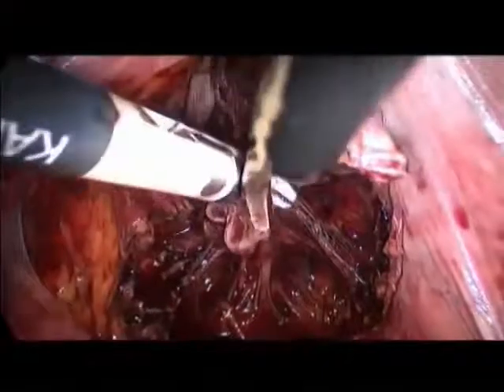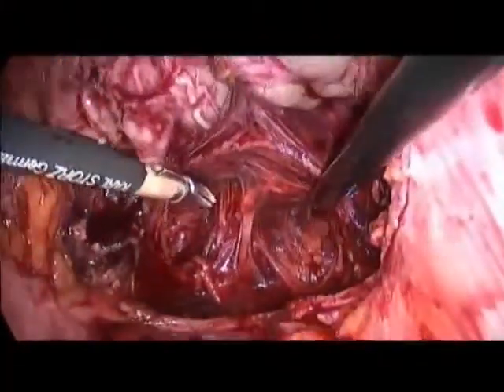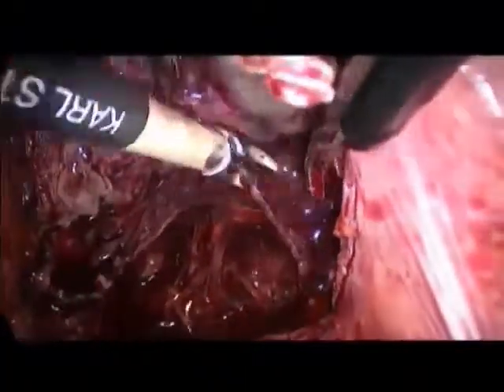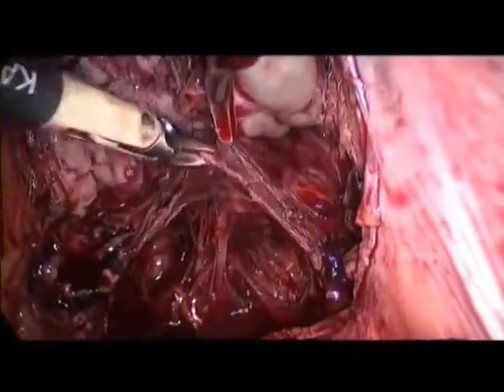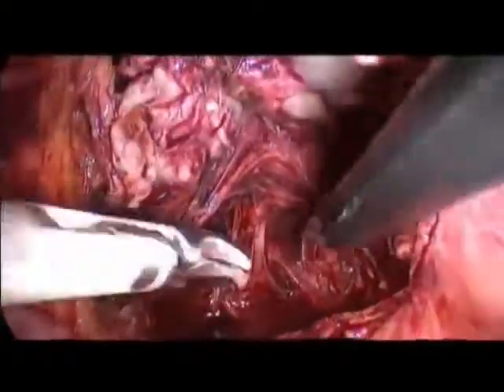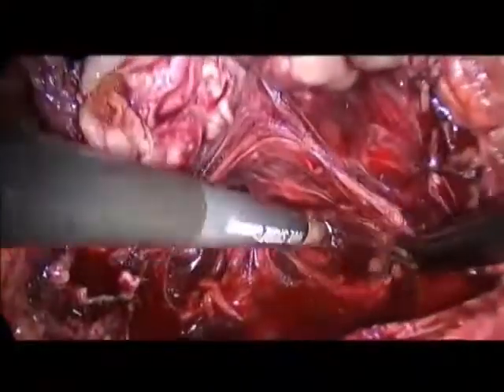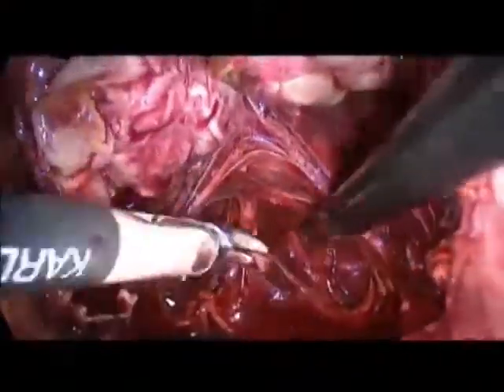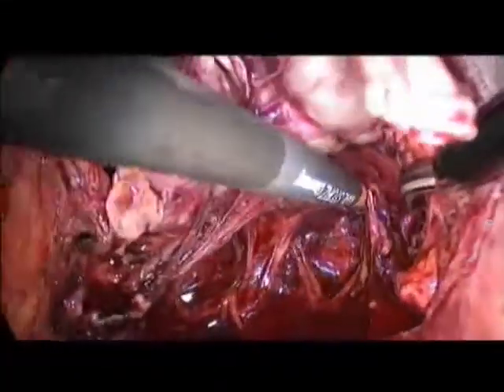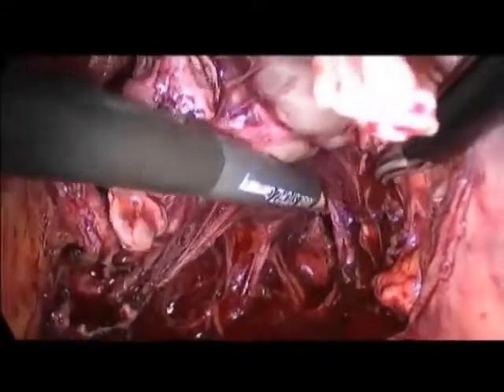And what you see here, lifted, is the opening of the Denonvillier. But in fact, the Denonvillier is still adherent to the base of the prostate because it was recognized early in the dissection and we passed immediately below it. In the midline, you have the rectum and we have slightly developed the fossae on each side just to have the medial landmark of the upper pedicles of the prostate that we will find later when we will have crossed the bladder neck from the anterior aspect.